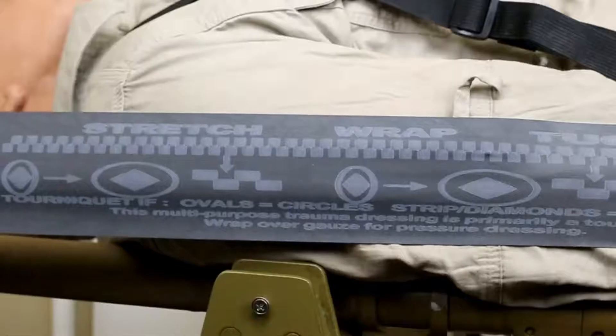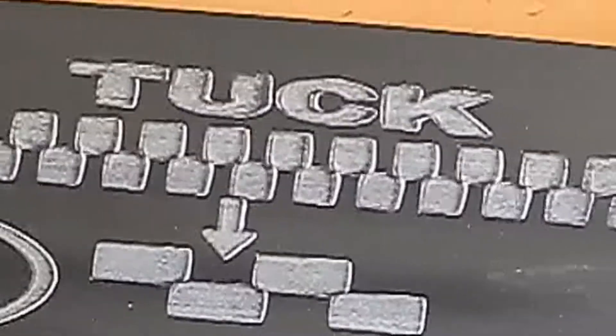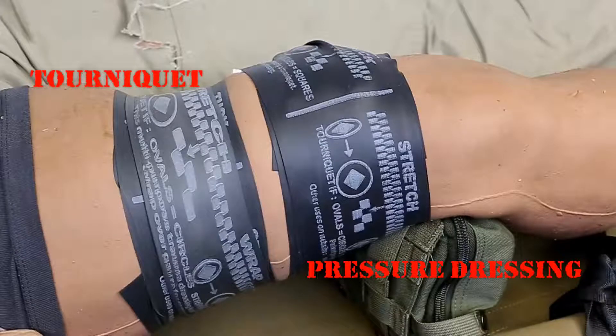Concurrently, the strip of rectangles above the ovals will become a strip of squares. When the SWAT-T is used as a pressure dressing, it should be wrapped tightly enough to apply pressure to the wound, but not so tightly that the ovals, diamonds, and rectangle strips distort to their tourniquet pressure indicator shapes.